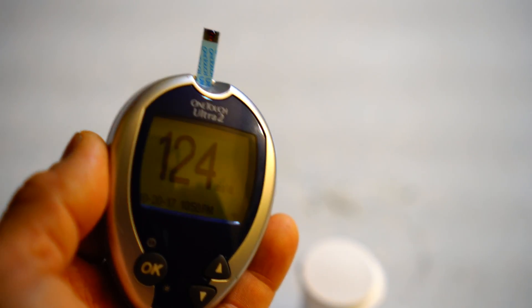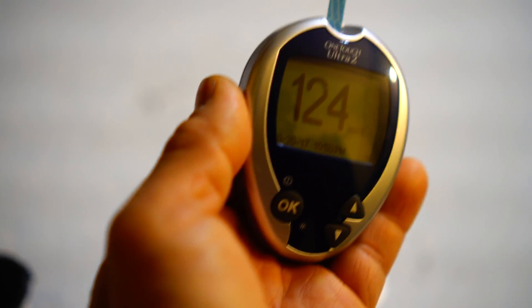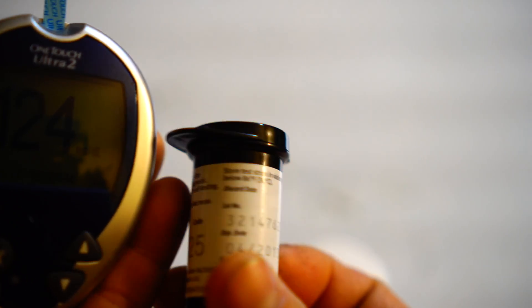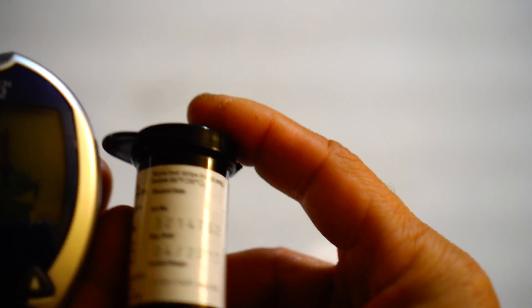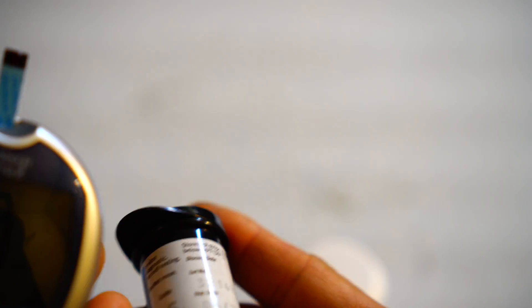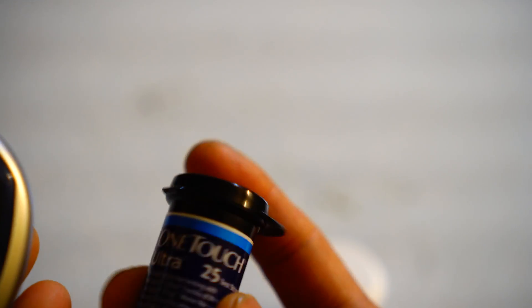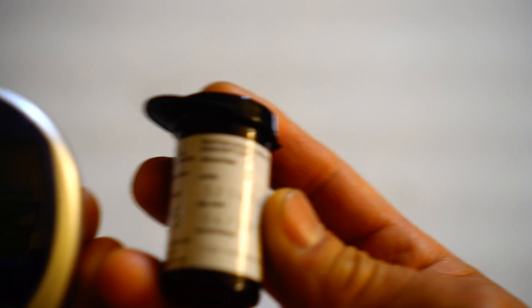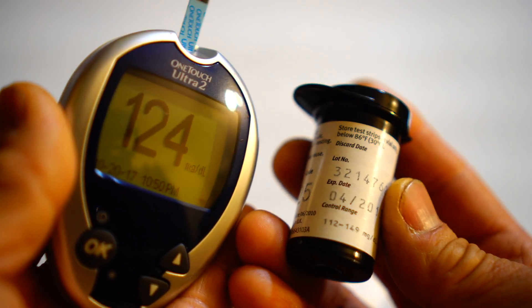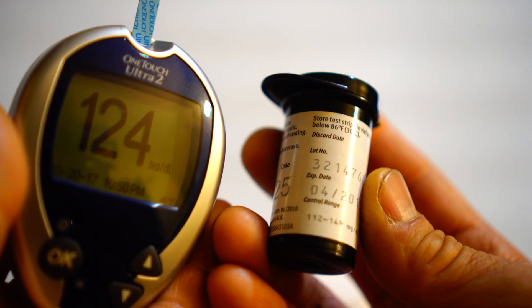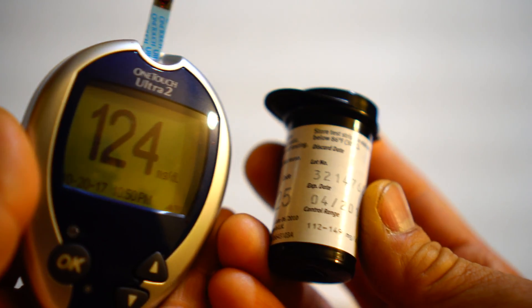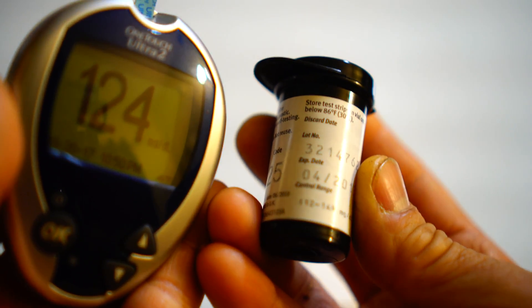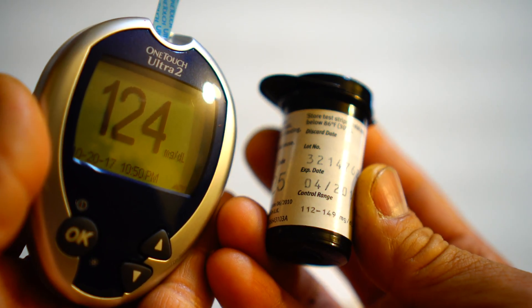124. The vial calls for—let me see what the vial says. The vial calls for 112 to 149, so this four-year-old test strip is able to meet the requirement within the control range.